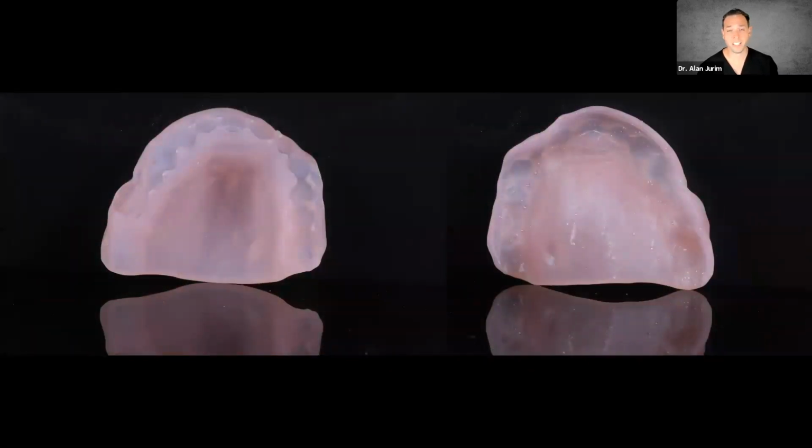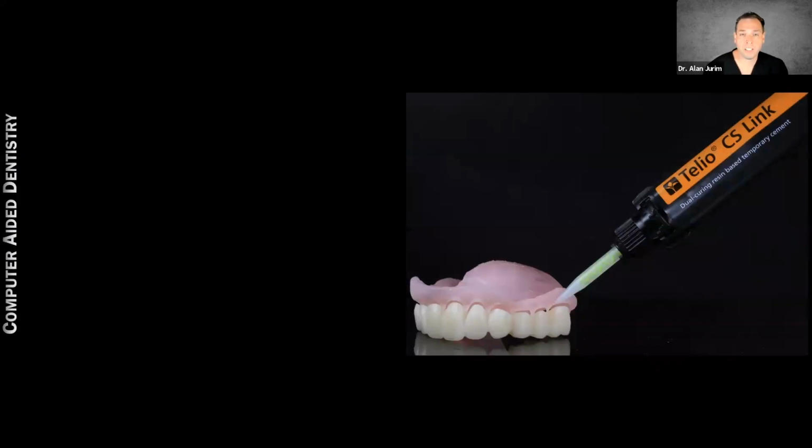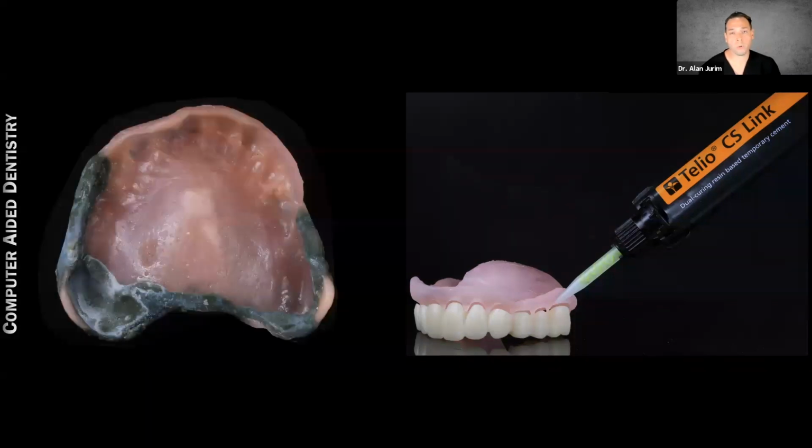So rather than taking the teeth and permanently affixing them and giving this to the patient and saying, okay, I'll see you back in 10 days and make adjustments after adjustments after adjustments, we tried to think a little bit out of the box, and this is what we were able to do. So rather than permanently bonding in the teeth, we put the teeth in with some temporary cement, and then we take the denture and we do arts and crafts time.